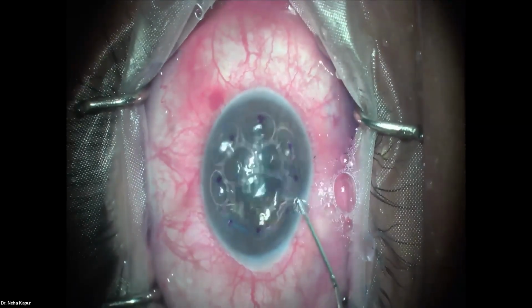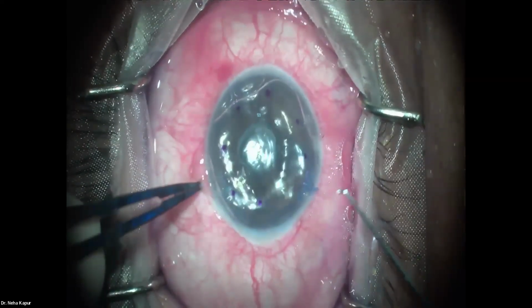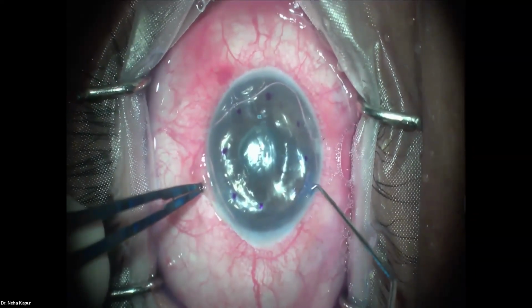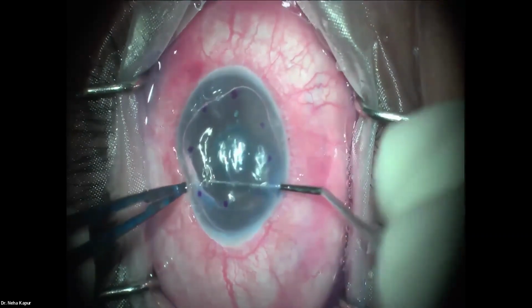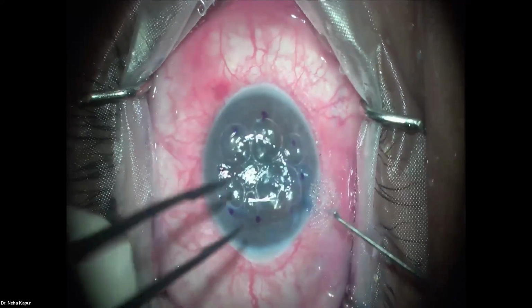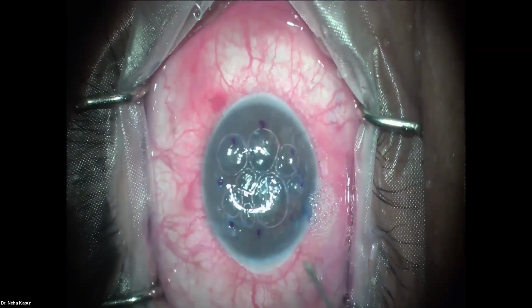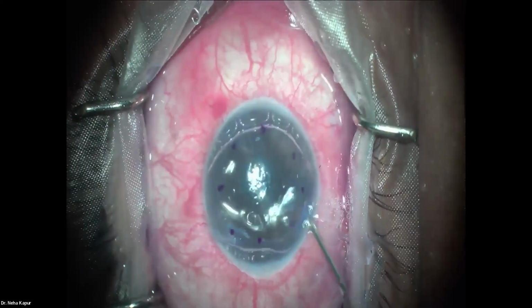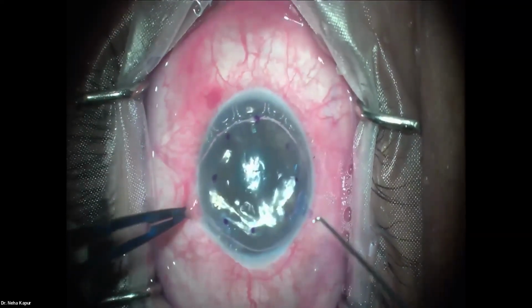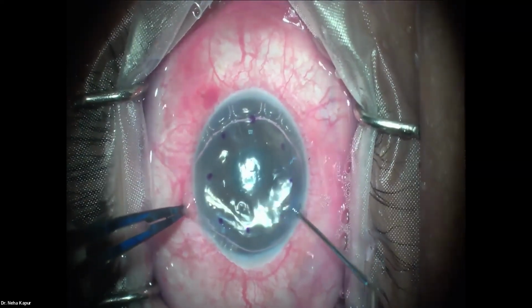So this is a situation where an AC maintainer actually helps because this constant in and out is avoided. But as you can see, there's a little tag of DM remaining here. We would like to address that and take that out also. And that completes the Descemet stripping under air. We'll have a final check. See, there are no more tags anywhere. Probably one segment here and one segment here.